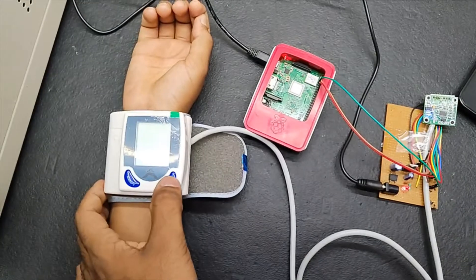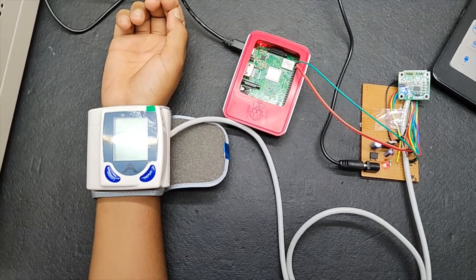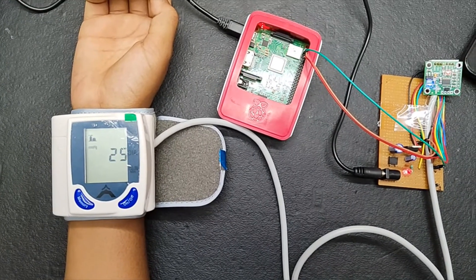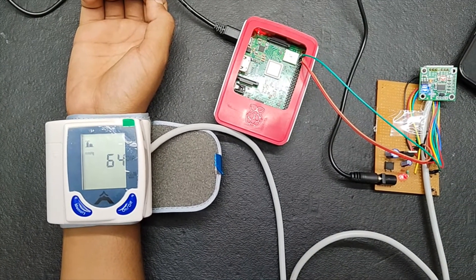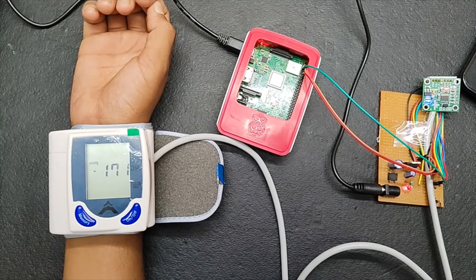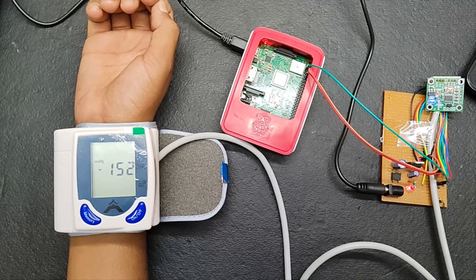Now we are turning on the device. To complete the whole operation, it takes up to a minute.